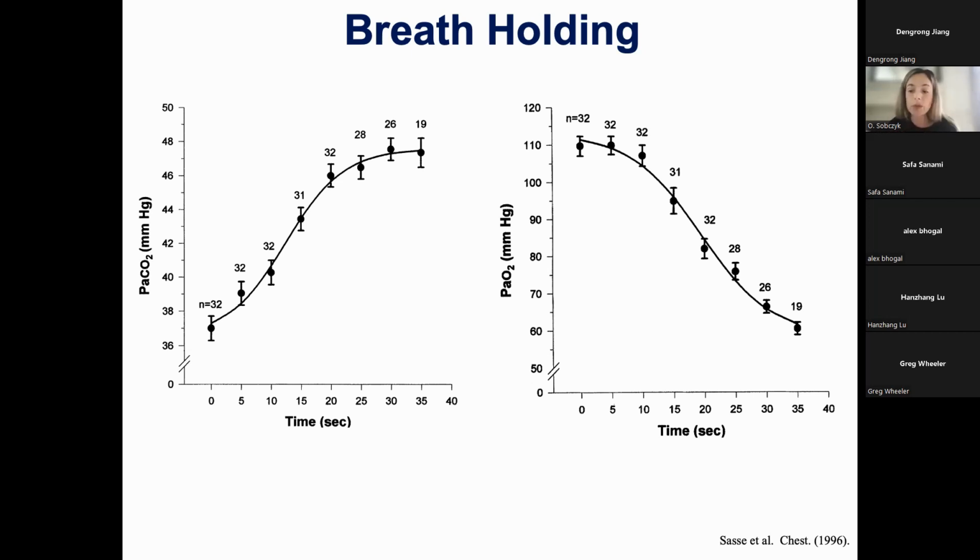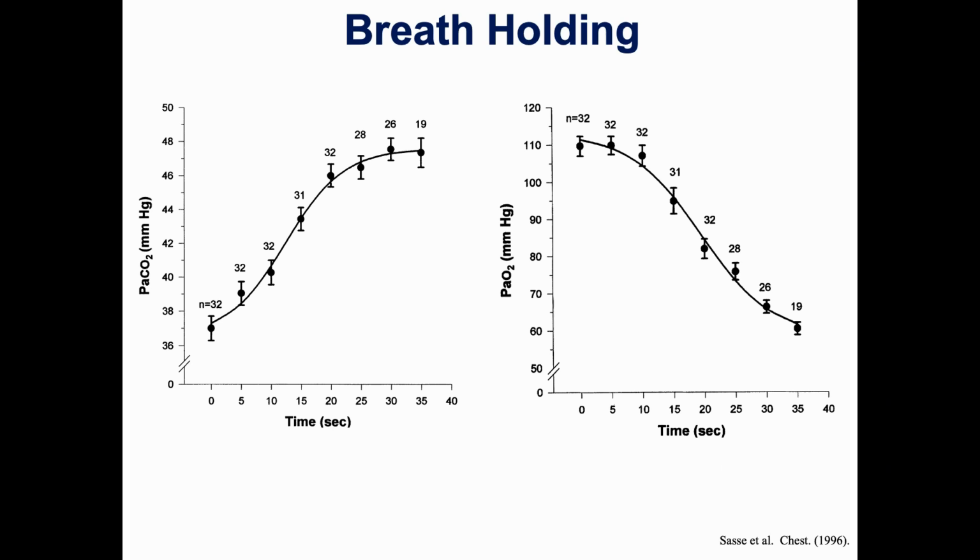Also, the amount of CO2 that rises will depend on whether you fully expire before you breath hold or whether you hold your breath at the end of inspiring. So there are lots of influencing factors with breath hold that you just have to keep in mind and take into account when you're determining your breath hold paradigm for your study.